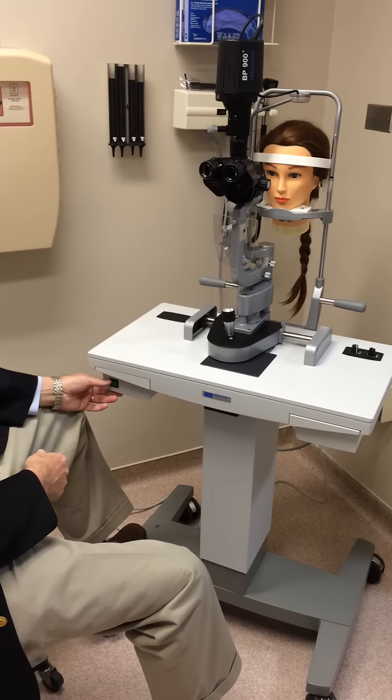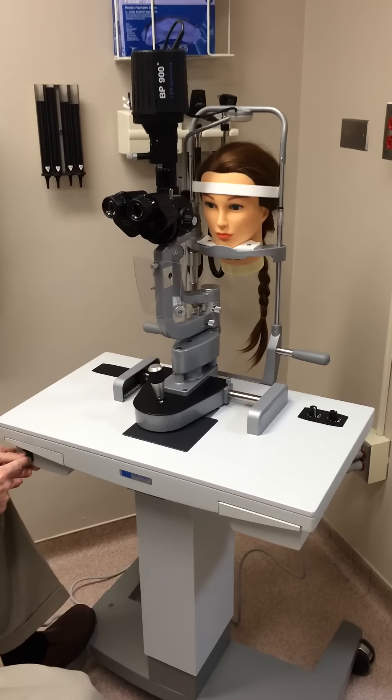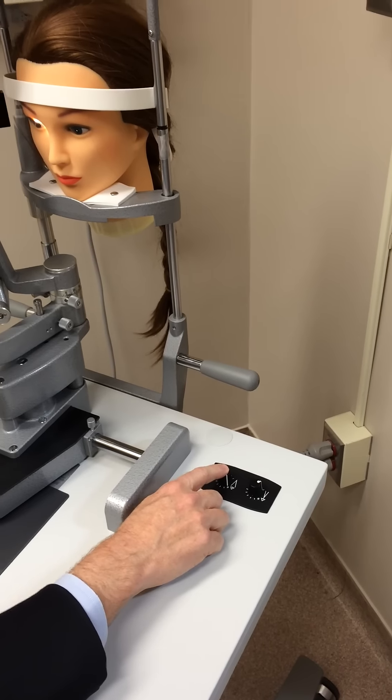Here's our new slit lamp. It is very similar to the old lamp, but has a couple of differences. The on button is down here. The rheostat to make it brighter or less bright is over here. This button is actually of no use to anybody.